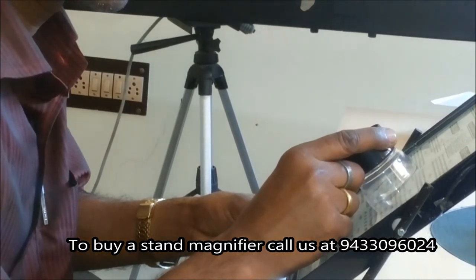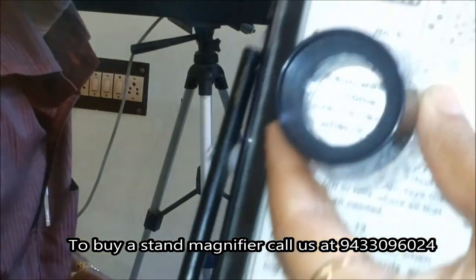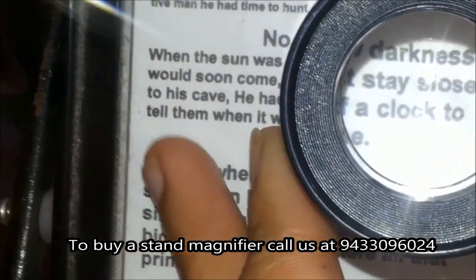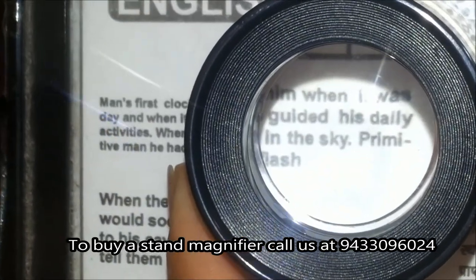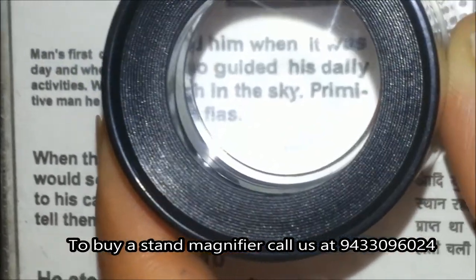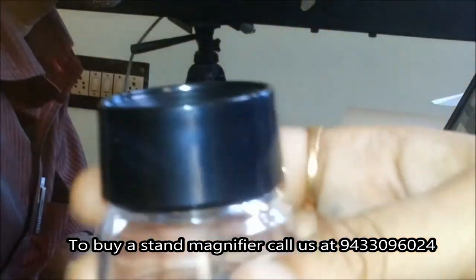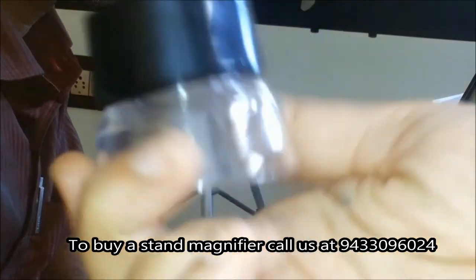This is also a type of stand magnifier. If I want to show it to you, you can compare. This is the original size, and through the magnifier you can see the magnified size. Now this is N6 line, so this is 5x magnification. The body is totally made of acrylic in this case. This is also a type of stand magnifier.